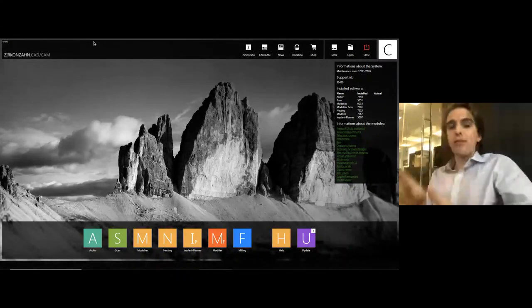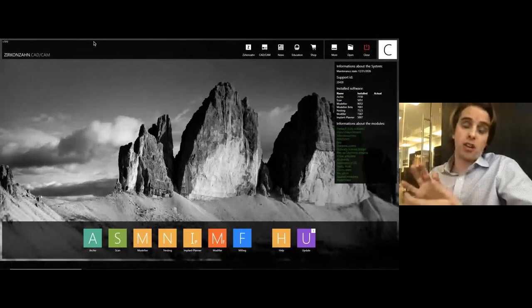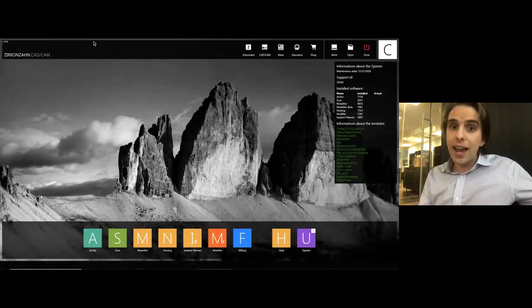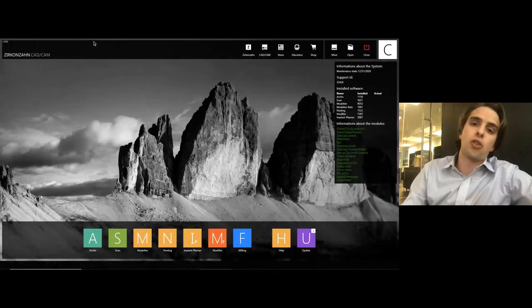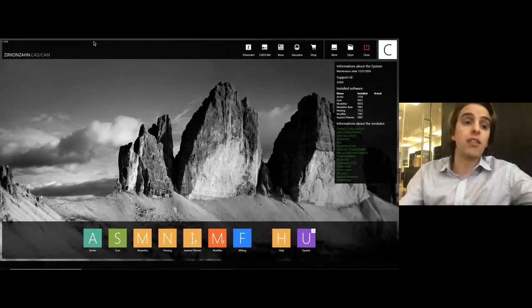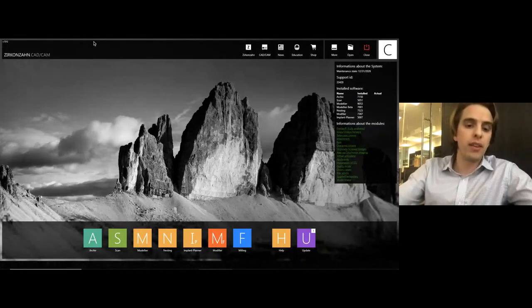And once we have the project registered on an articulator, whether it's in the analog world or the digital world, we move this to the lab bench, our waxing stations. And in the Zirkonzahn CAD/CAM suite, this is known as the Zirkonzahn Modellier and the Zirkonzahn Modifier software.